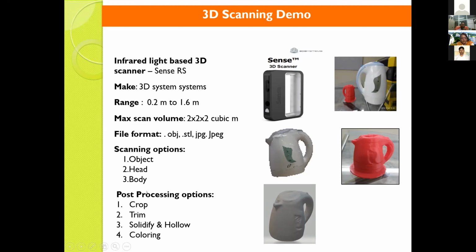Then after scanning, we do some post processing, like cropping of the model, removing undesired scan points, and this solidify and hollow base option.